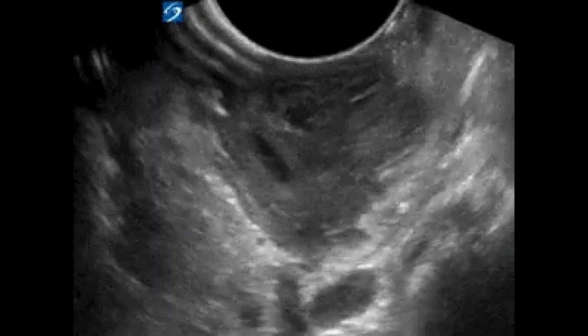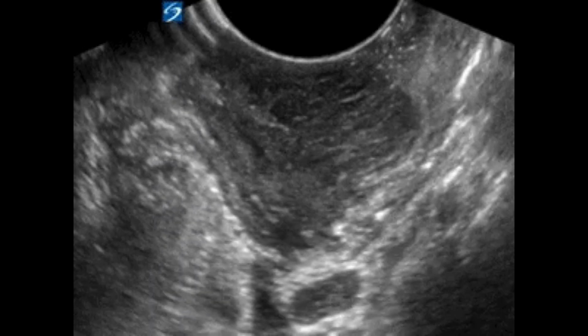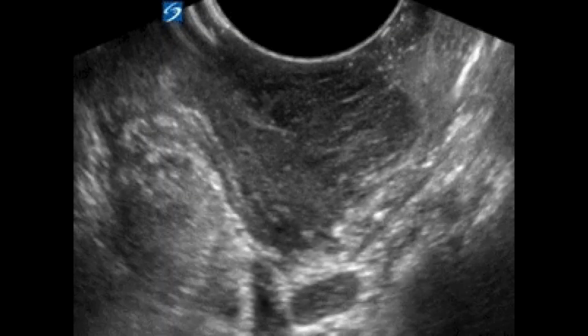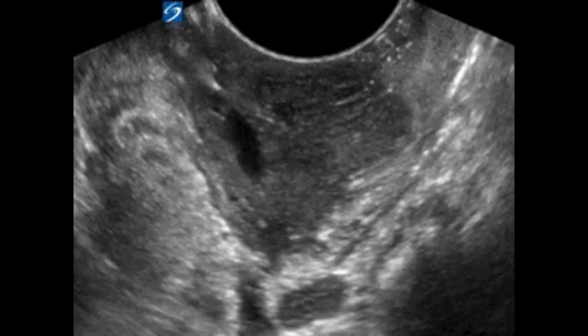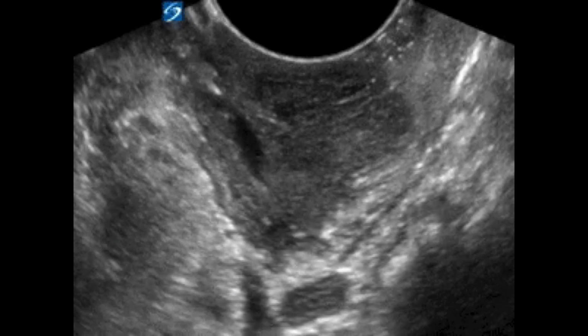So you can do this in real time. They have to have a big enough mouth to be able to fit the needle and the ultrasound transducer in, but this is something that's doable. There's a nice kind of element to be able to say, hey, I did this under ultrasound guidance.